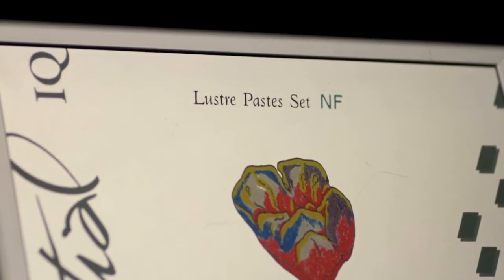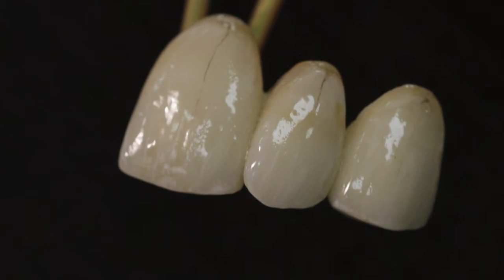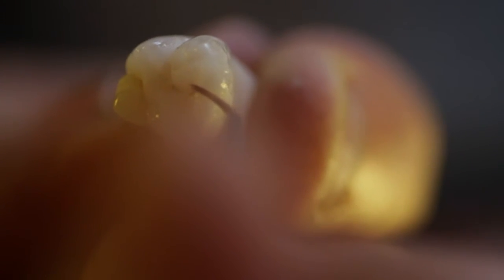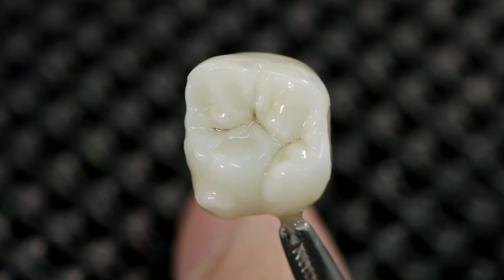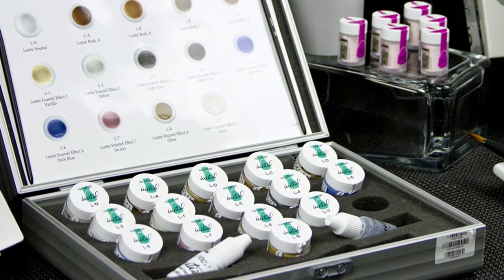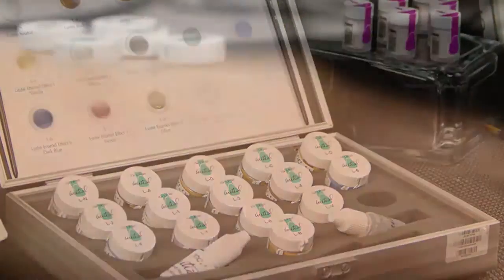GC Initial IQ Lustre Paste NF are three-dimensional ceramic pastes developed to bring color, depth, and lifelike translucency for the complete GC Initial ceramic range. Thanks to their new formula, you can now really bring your crowns and bridges to life with this dedicated Lustre Paste NF set, with an optimal match to both low and high CTE ceramics.